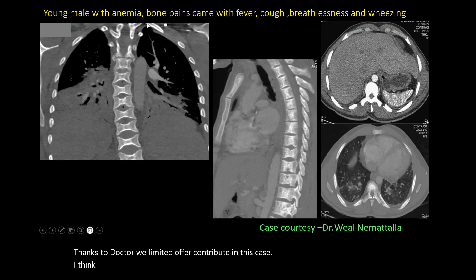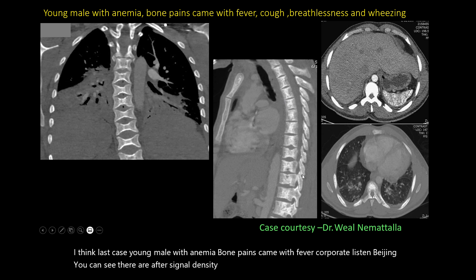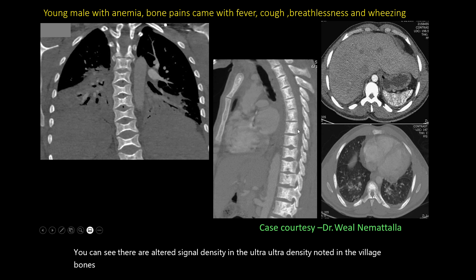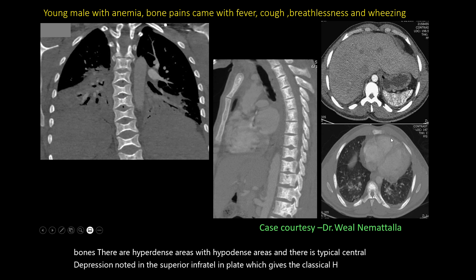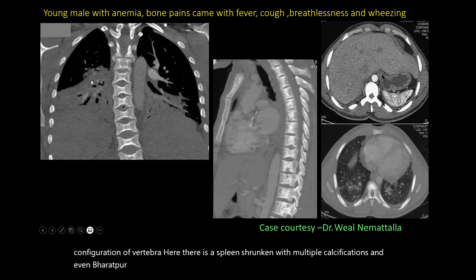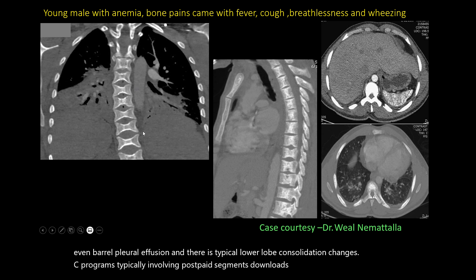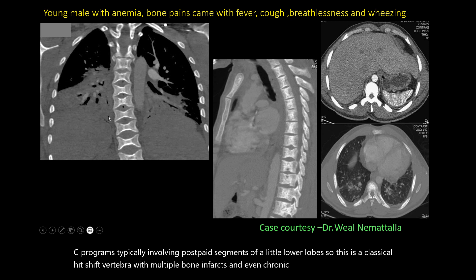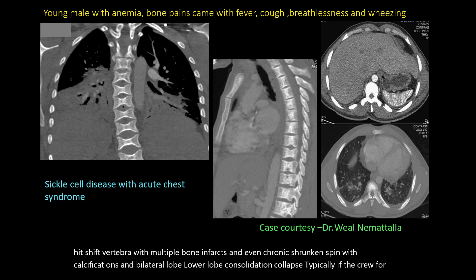Last case: A young male with anemia and bone pains, presenting with fever, cough, breathlessness, and wheezing. There are altered density changes in the visualized bones — hyperdense and hypodense areas — with a typical central depression in the superior and inferior vertebral endplates, giving the classical H-shaped vertebra configuration. The spleen is shrunken with multiple calcifications. There are bilateral pleural effusions and lower lobe consolidation with air bronchograms, typically involving the posterior basal segments bilaterally. The H-shaped vertebra with multiple bone infarcts, chronic shrunken calcified spleen, and bilateral lower lobe consolidation gives the classical clue for sickle cell disease with acute chest syndrome.